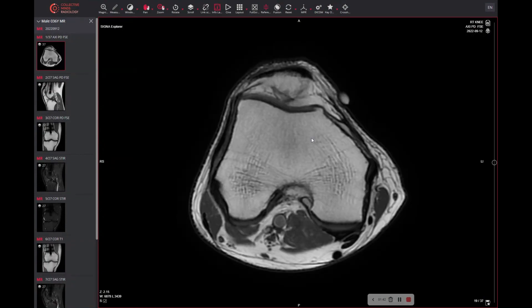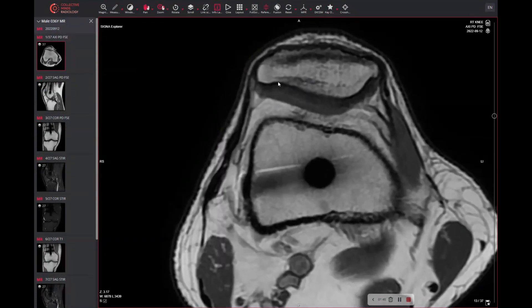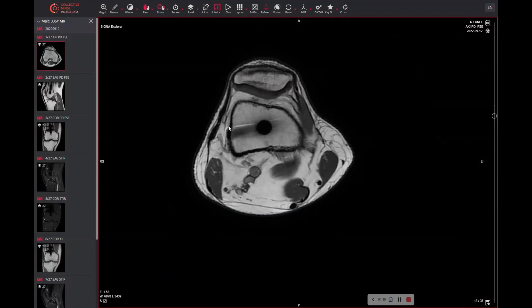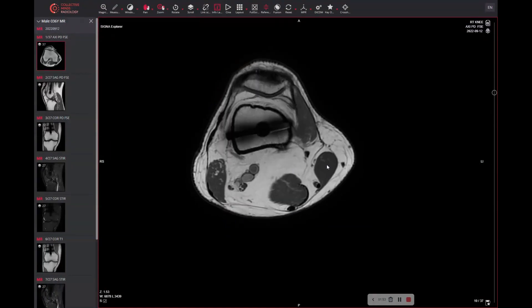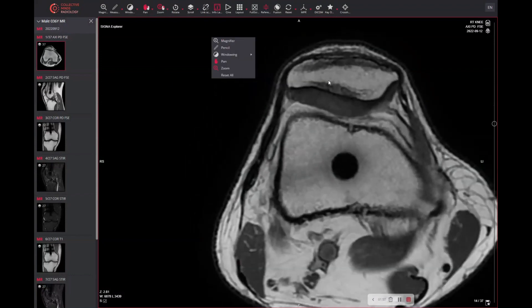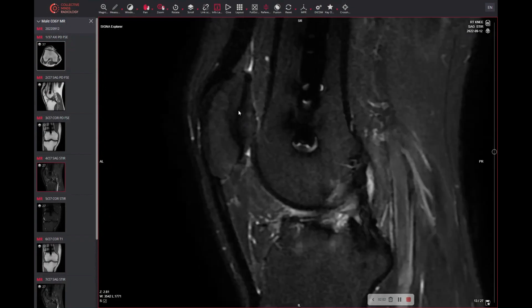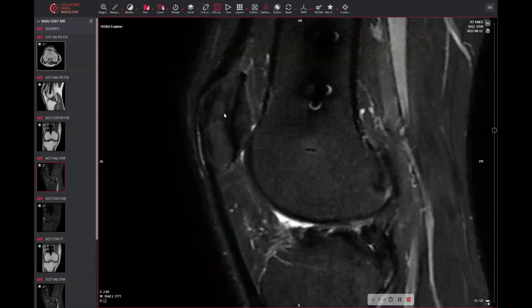We can also see this on the axial. We can see this line here — that's what we want to focus on. First of all, you can see it's parallel to the lateral facet. This is the medial and lateral patellar facet there. You want to make sure that there is no edema, and we can see there is absolutely no edema here in that location. So what is it actually?